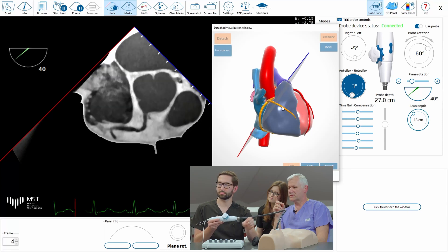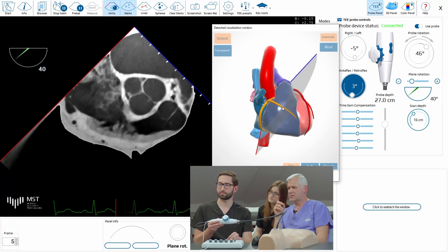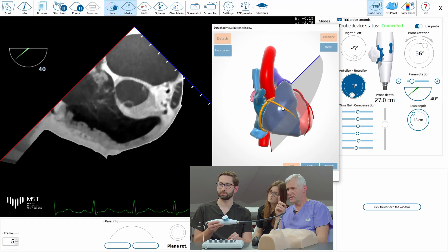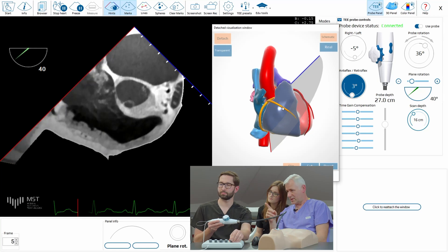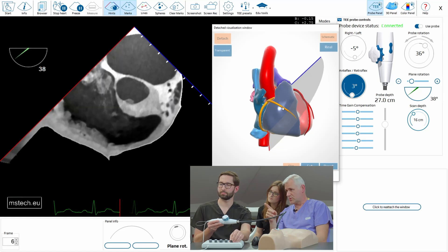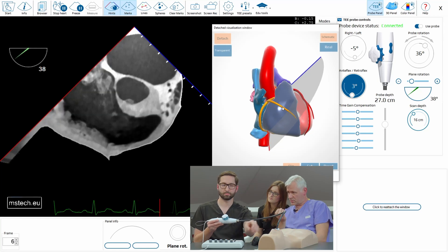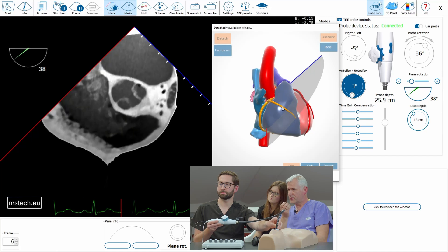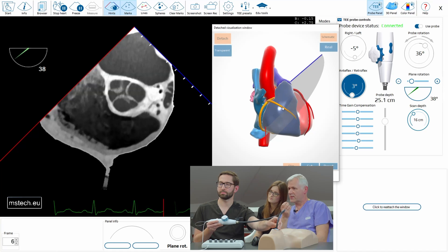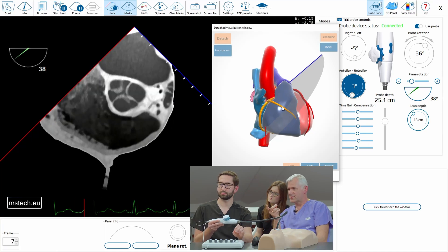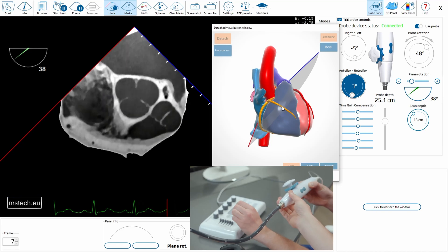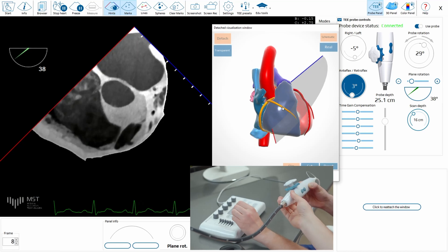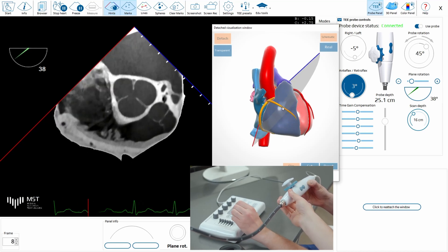Keep the aorta in the center — it's really important. Now you are slightly too deep, so pull a little bit back. Keep the aorta in the center by rotating. Now it's in the center.